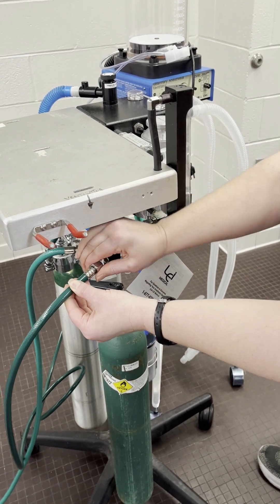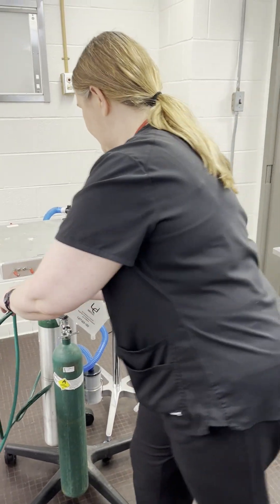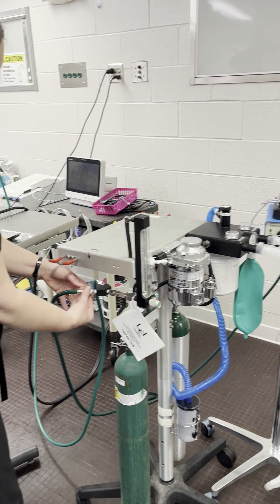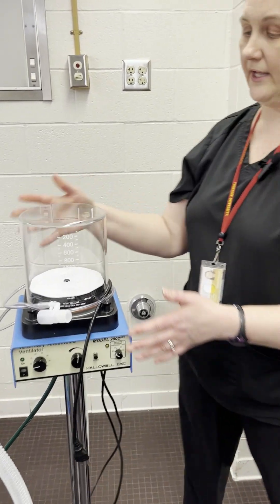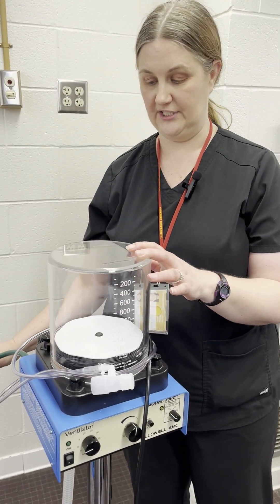Now, what that means is that the oxygen coming in through the anesthesia machine is going to fill the bellows on the inside. And then the driving gas for the bellows of the Hallowell is on the outside, and that is why the Hallowell needs its own oxygen supply.